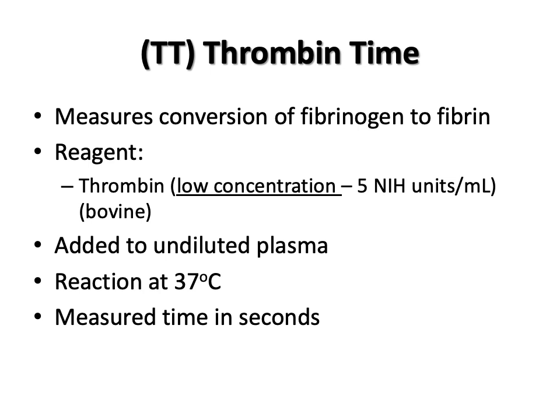The reagent is pre-warmed to 37 degrees and must be used after 3 minutes, but within 10 minutes of incubation because the reagent deteriorates with incubation. It is added directly to undiluted patient plasma. The reaction occurs at 37 degrees and is measured in seconds.